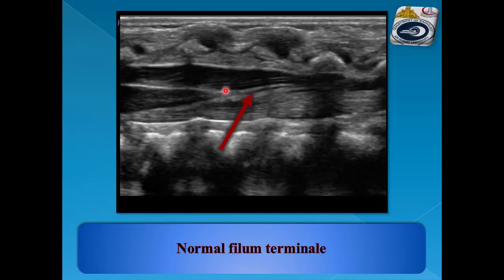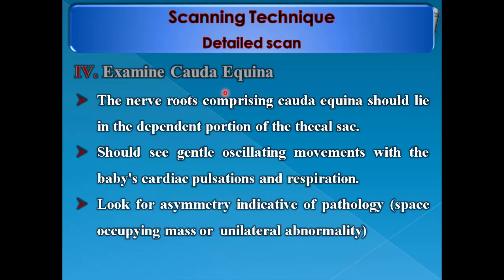This is the appearance of the filum extending from the conus — we can follow it downward to S2 vertebra. The fourth question is: examine the cauda equina. The nerve roots comprising the cauda equina should lie in the dependent portion of the thecal sac. You should see gentle oscillating movements with the baby's cardiac pulsations and respiration. Look for asymmetry indicative of pathology.